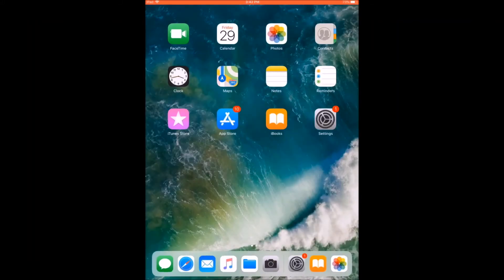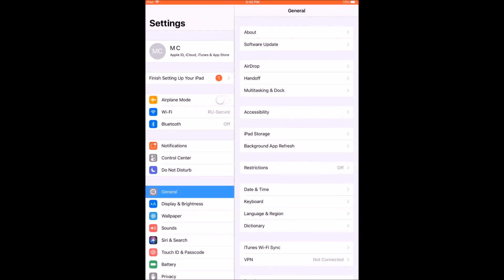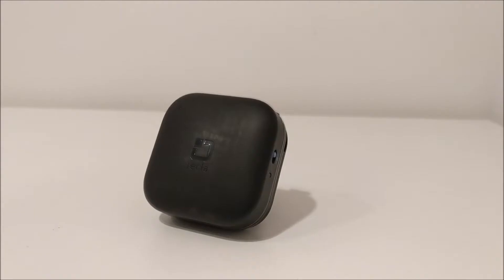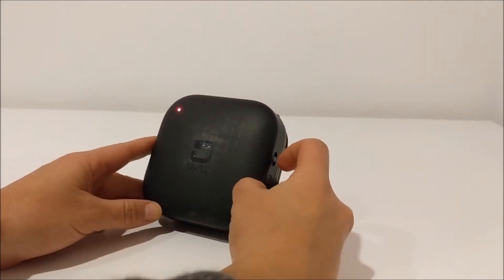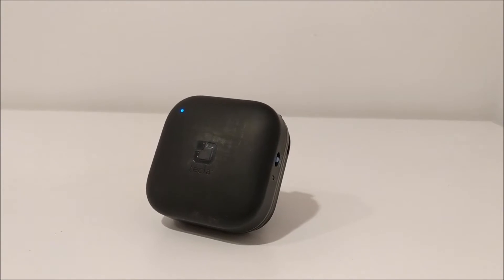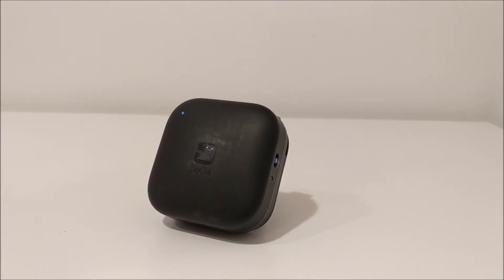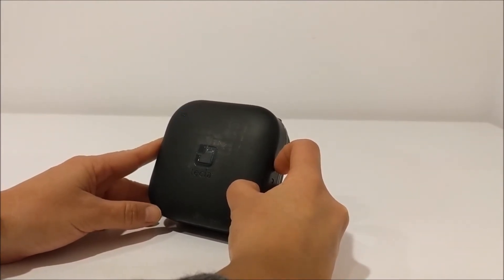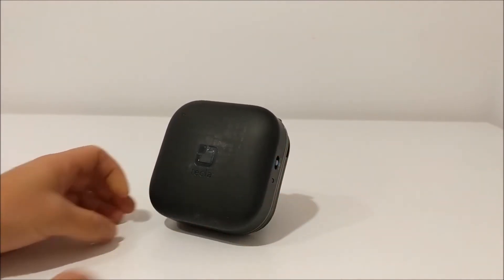To set up your Tecla E with multiple devices, first you need to pair them via Bluetooth. On your first device, go to Settings, Bluetooth, and turn Bluetooth on. Then turn on your Tecla E by sliding the three-way power switch to the middle position. To put your Tecla E in pairing mode, slide and hold the blue power switch to the bottom-most position for three seconds, at which point the Tecla E will make a pairing sound.